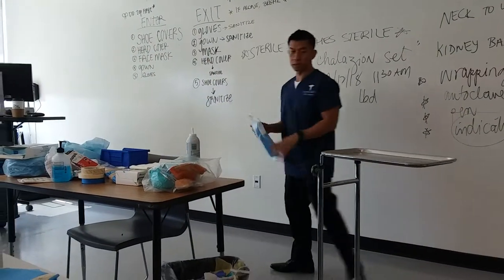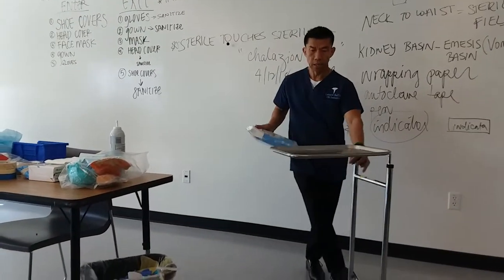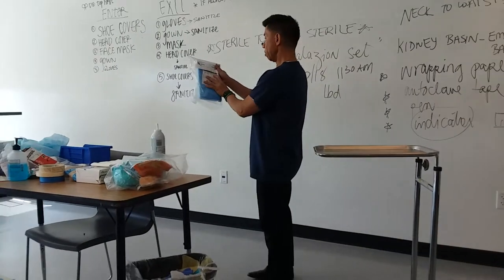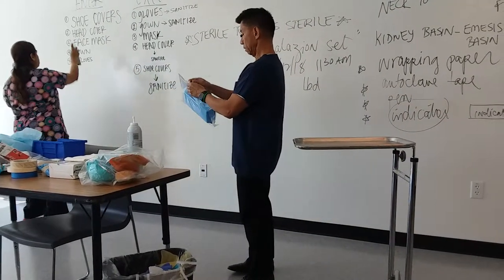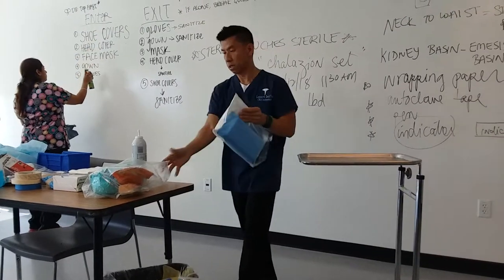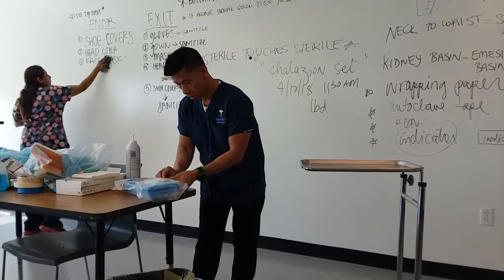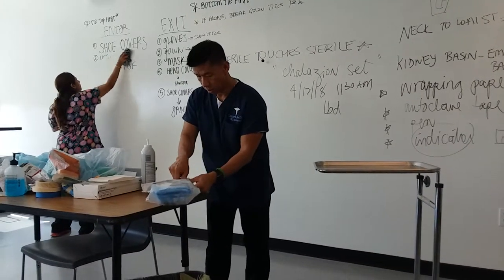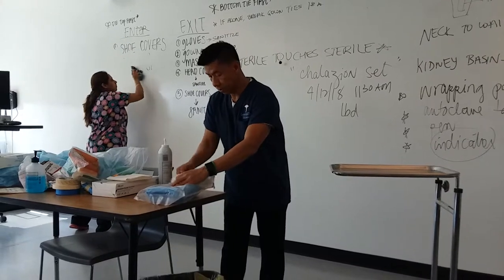Now I am setting up a laceration tray because the doctor is going to perform a laceration procedure. Here's a tray — this is the name of the supplies.